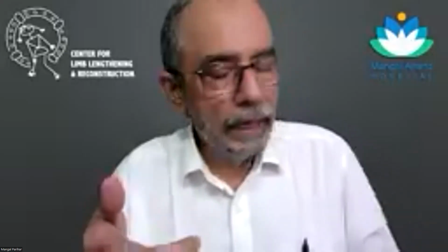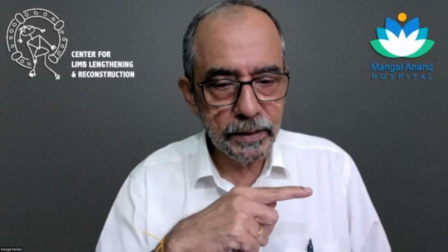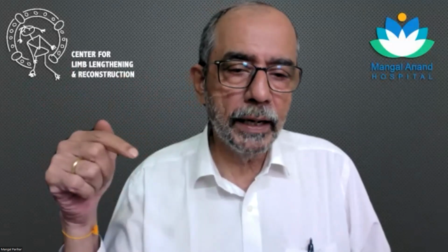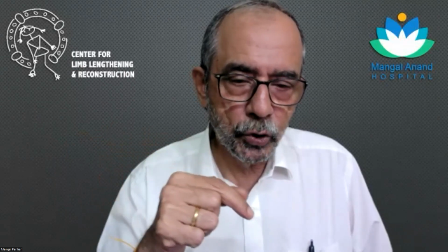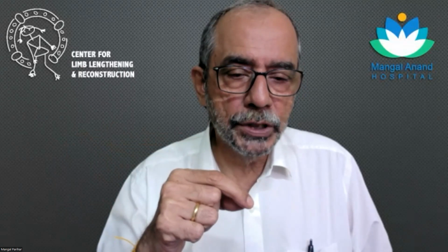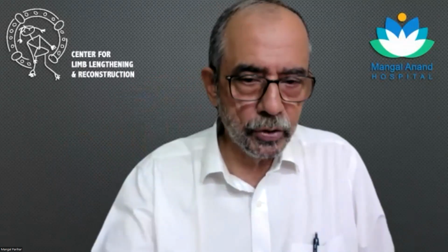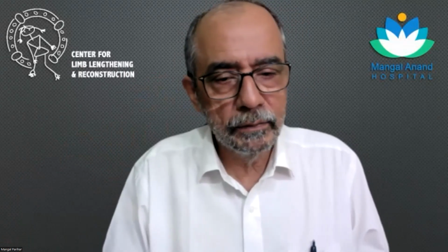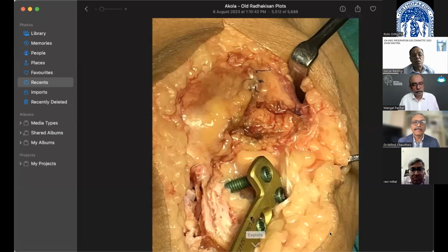Yeah. So yes, I had the privilege of assisting Staubli in a couple of cases in Mumbai. So I had that concept, and I am always very, very careful. Sometimes, even if I go through the posterior cortex a little bit, I will get a feel of it. And I'm sure this is the case with you also, that once you know about it, then it doesn't happen again. It happens a couple of times, but after that, it doesn't happen.